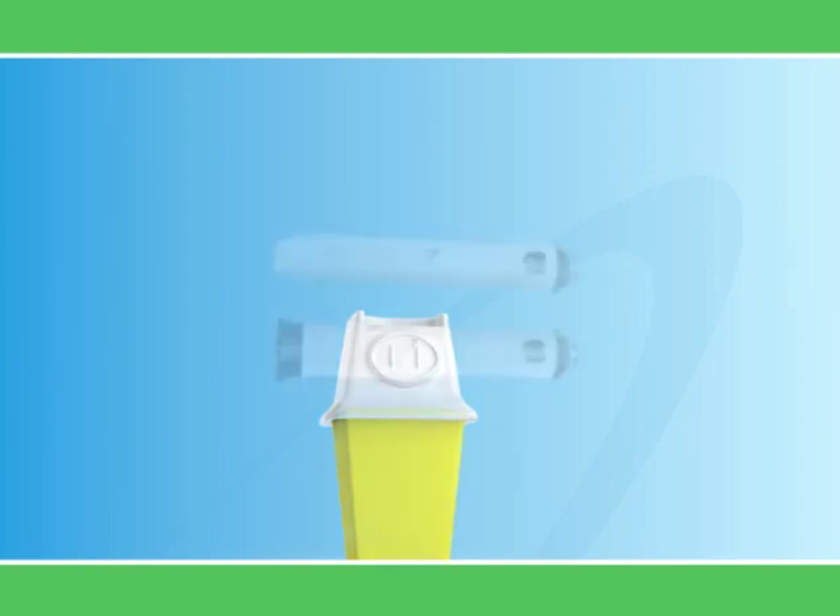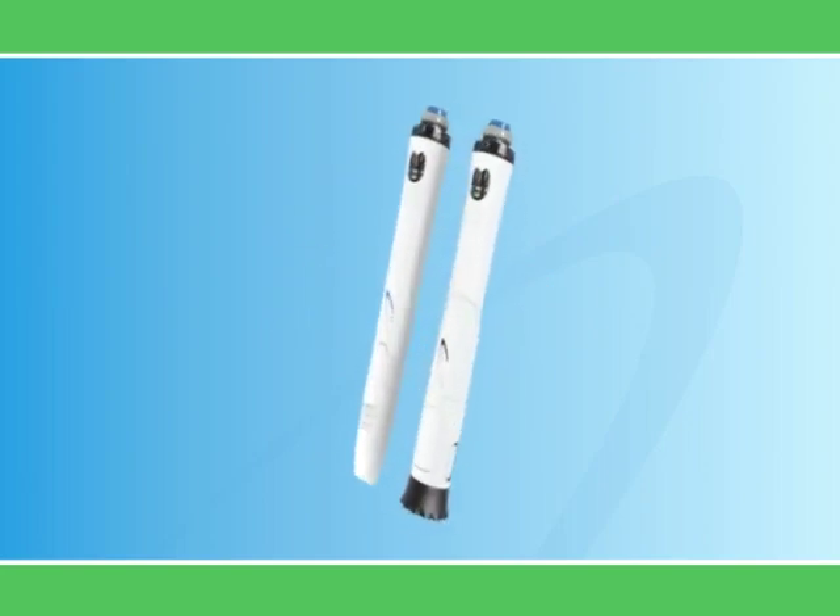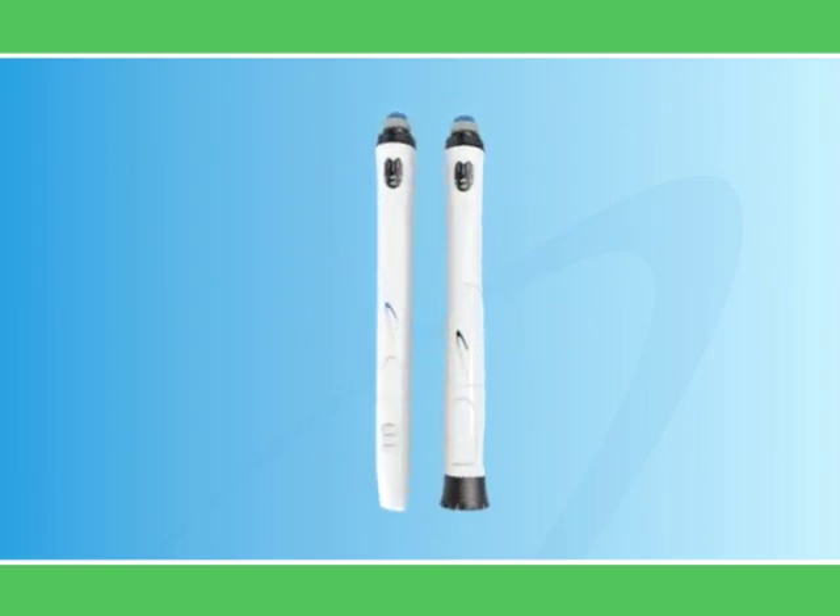Remember, whenever you open a new Go Quick Pen, you have to perform the one-time initial setup before using it. Now that you've learned this key procedure, you're ready to administer your growth hormone injection every day.